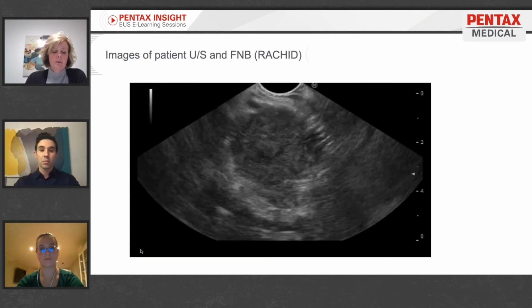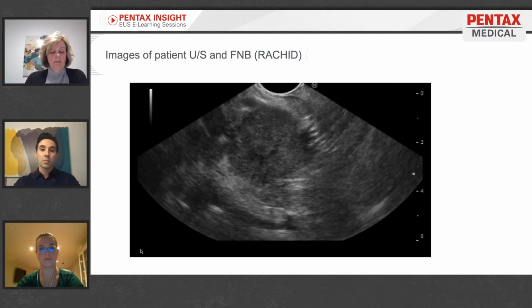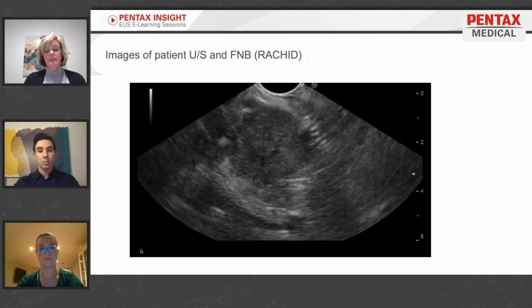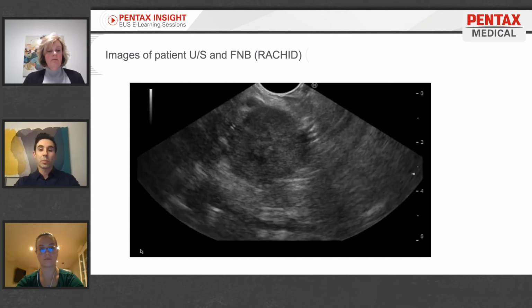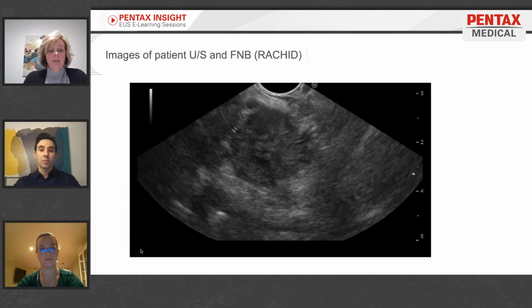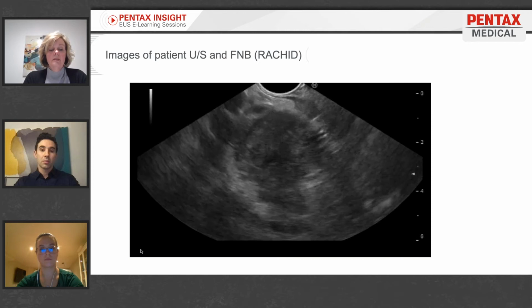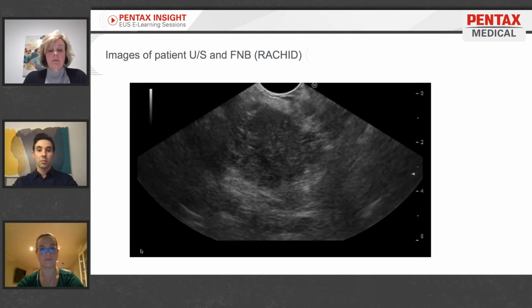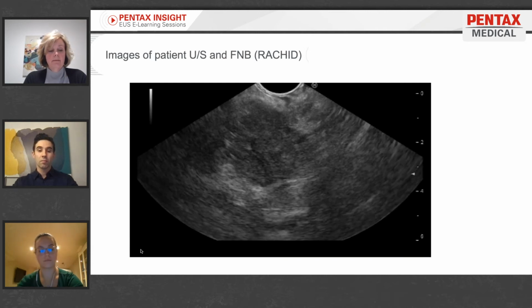You may also be asked to put the specimen in transport media, such as an RPMI, if they're thinking there's a possibility of lymphoma. The RPMI just ensures the cells remain viable until they can be examined. Following the FNA, the specimens are reconciled and sent to the cytology department. For an FNB, the sample is placed directly in formalin, as formalin fixes the tissue and does not allow it to degrade. Following an FNB, the specimen is reconciled and sent to the histology department.